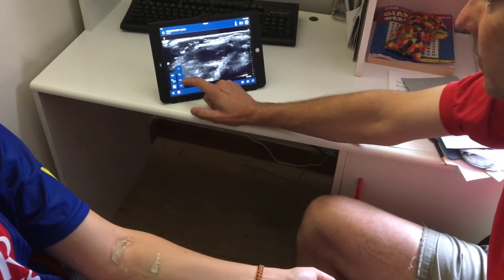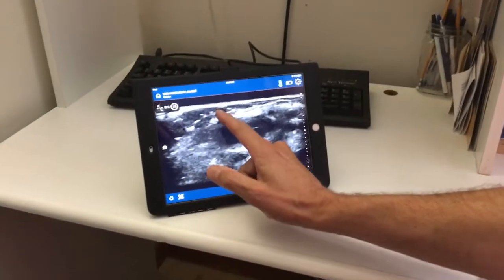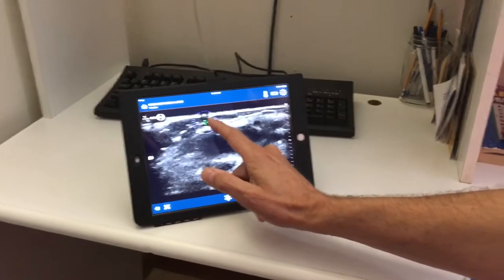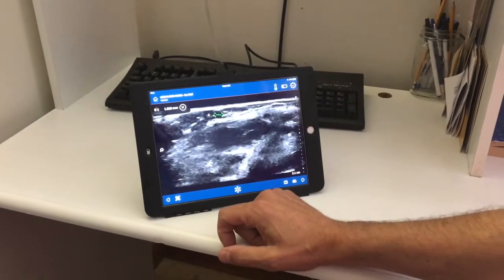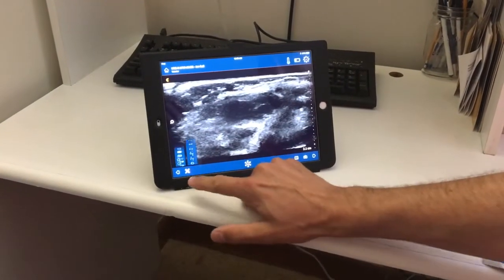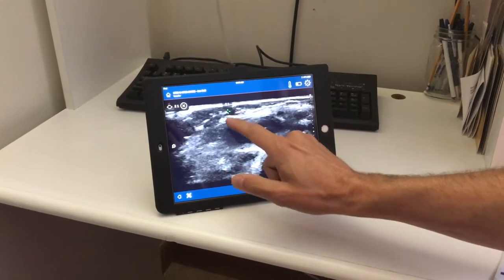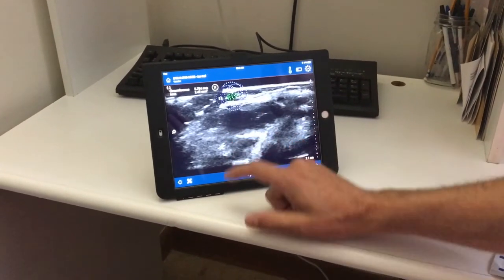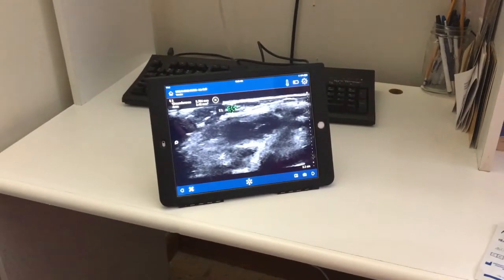We have different measuring tools — we can measure across and do a two-dimensional measurement. This vein is 1.8 millimeters, and we can get rid of that. We can also do a circular measurement that gives us our area of 2.48 square millimeters.